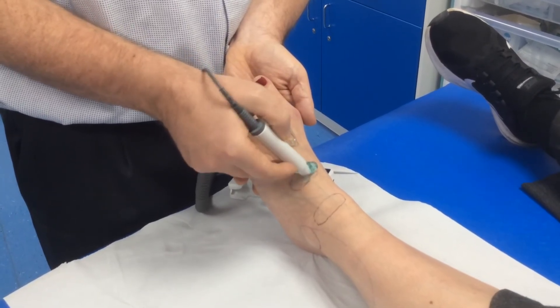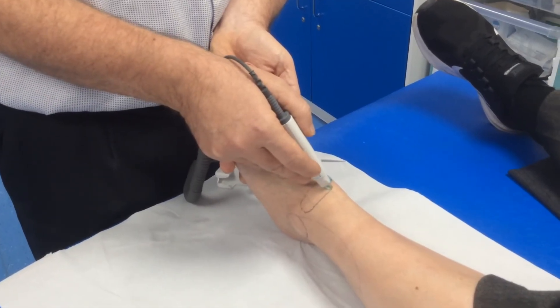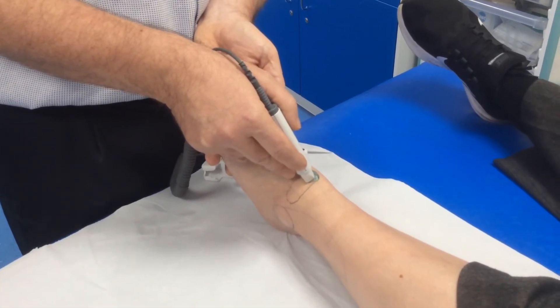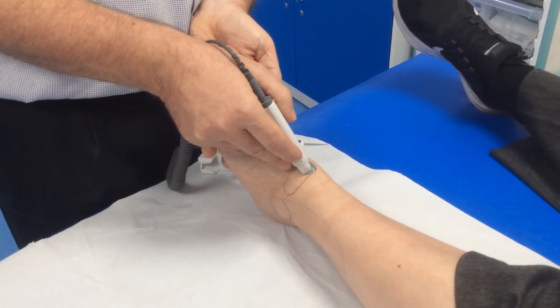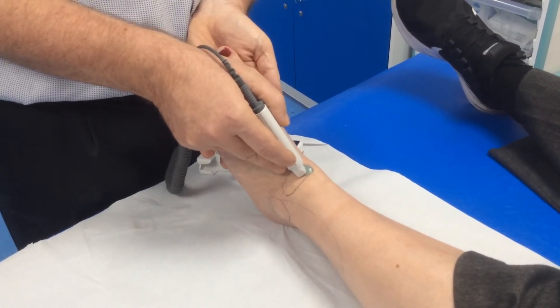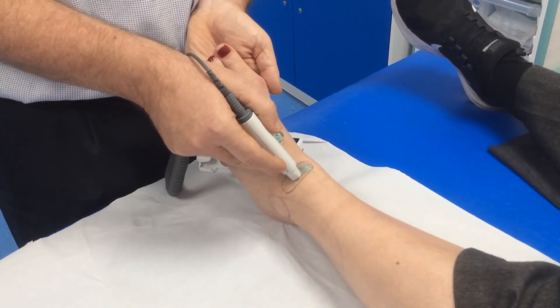If I failed to locate an audible pulse in that area, I would next look for the anterior tibial pulse across the ankle crease on the front of the leg. Again moving slowly, plenty of gel, searching for an audible signal.